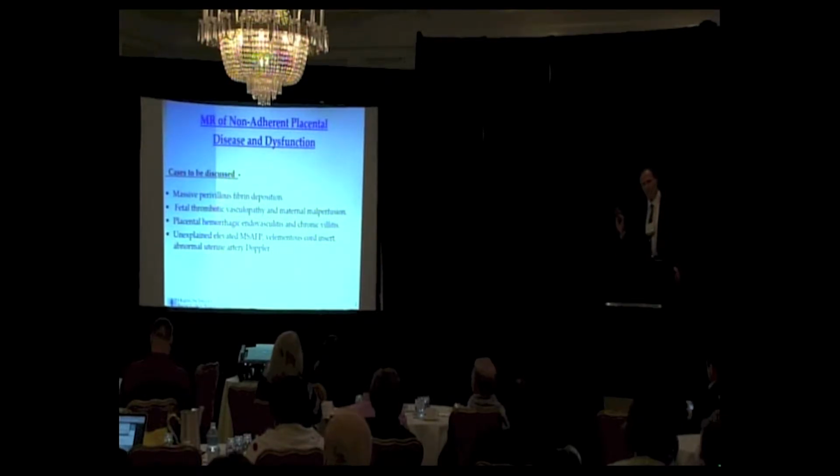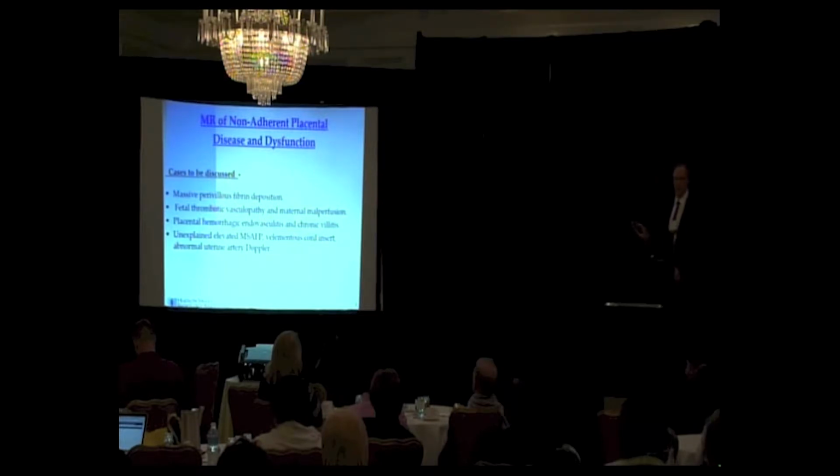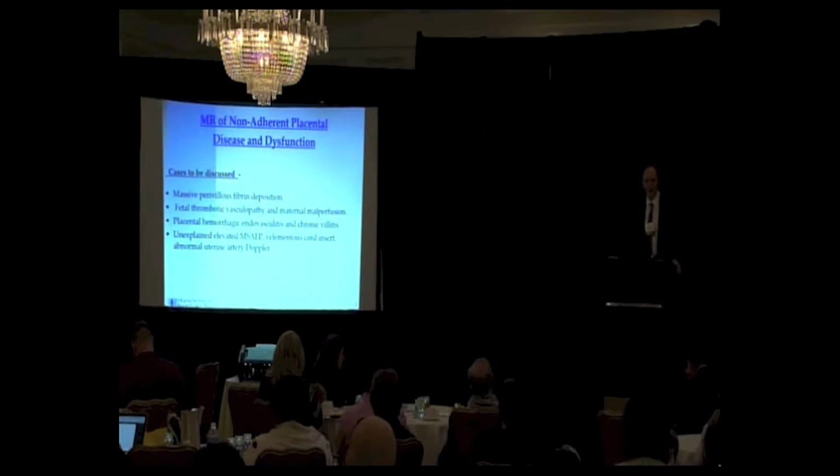From a practical perspective, when we see these abnormalities on MR, send that placenta to pathology for a high-quality histopathologic evaluation. When these diseases are identified, the patient is at increased risk of recurrence in their next pregnancy. And these are probably patients that should be treated with early institution of low-dose aspirin in the next pregnancy. So there are important clinical implications for identifying this disease, and the cases that I'm going to show today reflect how we stumbled upon this when the MFM was not suspecting placental disease.